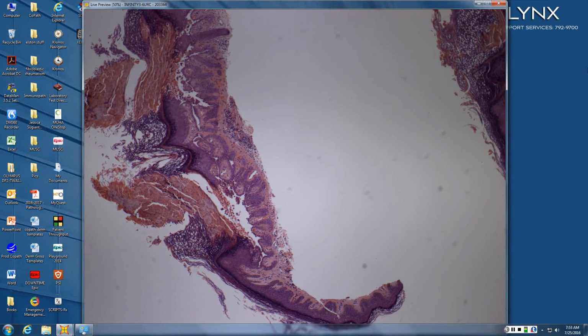And then you see the altered keratin. So what's your differential for this? It's not deep in a follicle. It's not really a big crater. So, Nicole, you want to help him out? If my brain was working, like an epidermolytic... I can never think of the name.